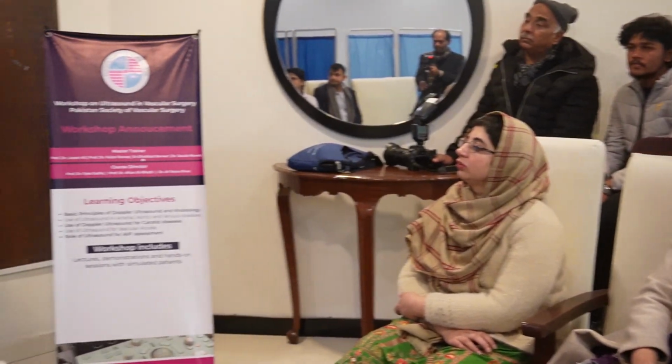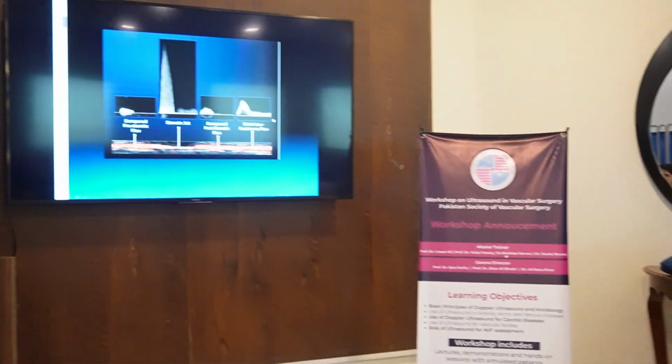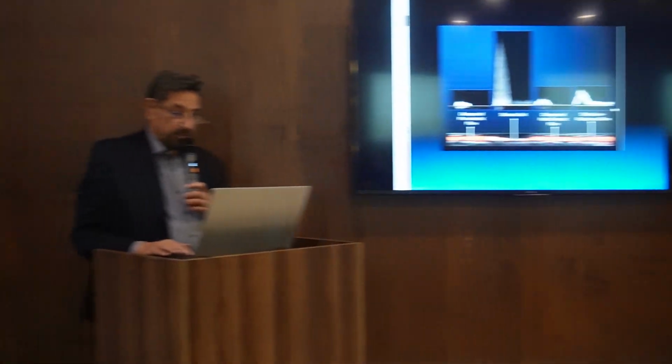If there is a normal triphasic waveform at the ankle, the exam is finished. That's the screening procedure. If there is that tardus parvus, slow upgoing wave, spectral broadening, no triphasic waveform, then they start performing from the aorta to the dorsalis pedis, otherwise they won't. So that was a screening program once conducted in European countries. I don't know whether it's still on or not.